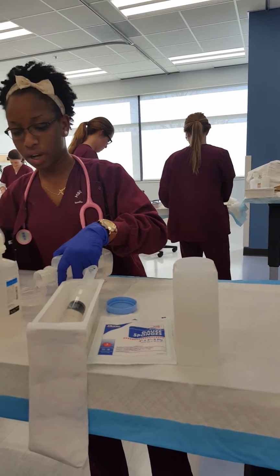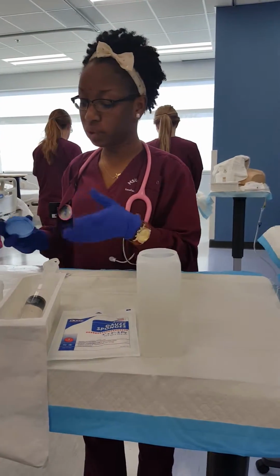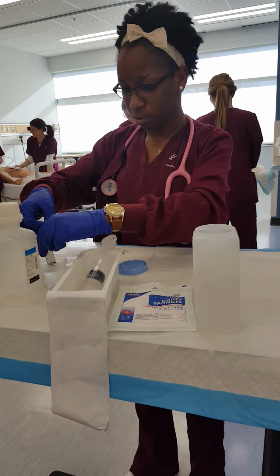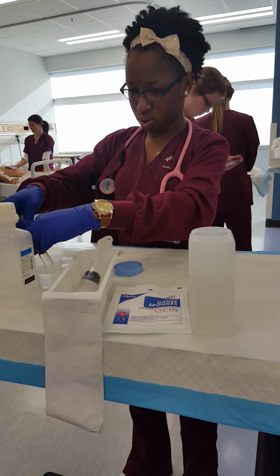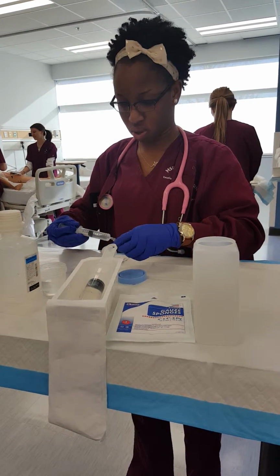I will be using the open method for my irrigation, and the closed method when I'm administering my medication. The book says that the patient should bear down, which closes things off, so I will be asking my patient to relax and exhale.